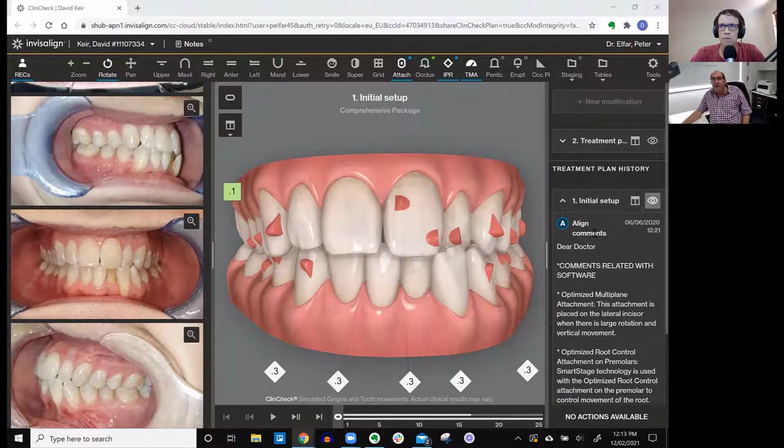So I'm looking at your intraoral photos, and you've got a very interesting and challenging case. I'm looking at the buccal segments, the molar relationship and the canine. You've got a beautiful, soft class 1 molar, premolar, and canine. So the last thing we want to do, on either your right side or your left side, because you've got a really nice class 1 soft occlusion on both sides, is to change your buccal relationship significantly. So if it's not broken, you don't want to fix it.